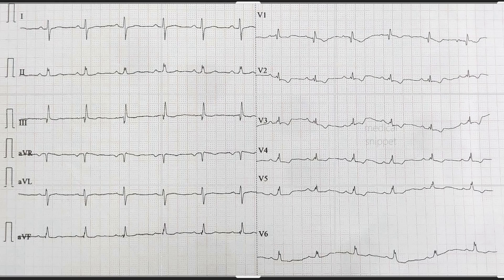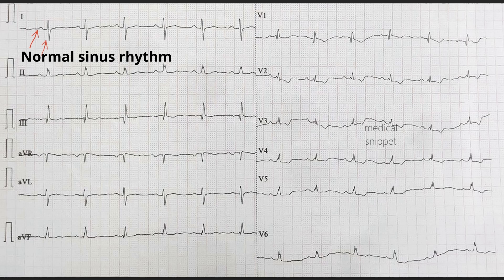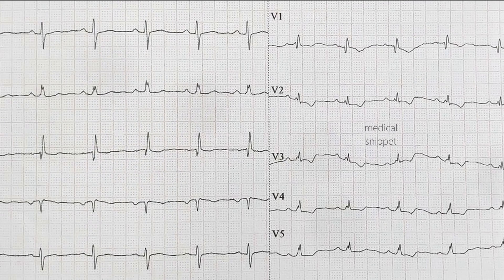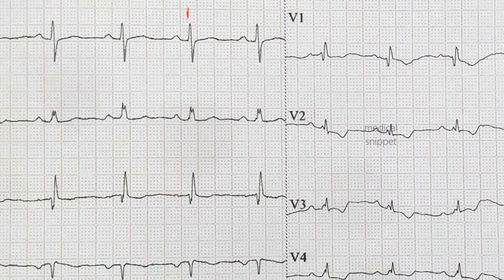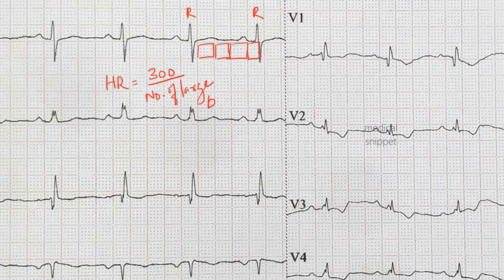This is the first ECG. Carefully look at it. The rhythm is sinus, as each P wave is followed by a normal QRS complex. The heart rate is 75 beats per minute, as there are four large boxes in between two R waves. The heart rate is 300 divided by 4, that is 75 beats per minute.